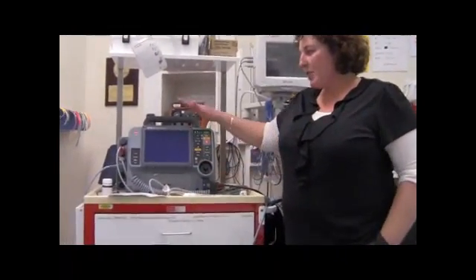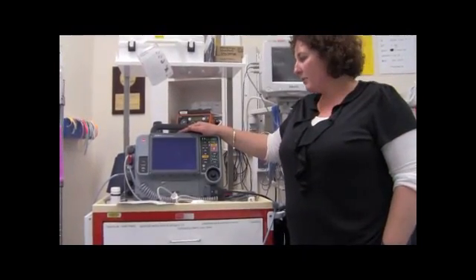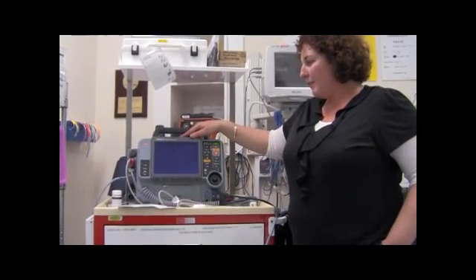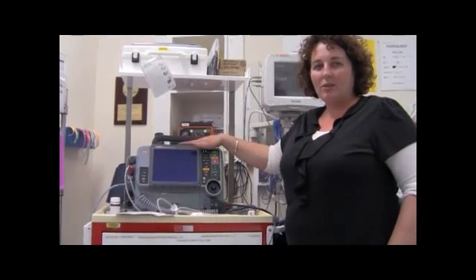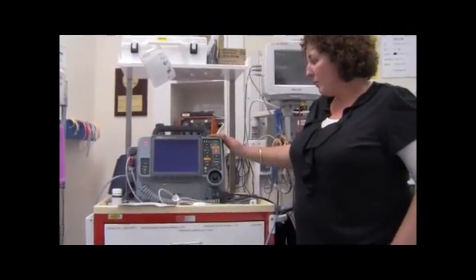So basically this machine is designed to monitor patients as well as to do some defibrillation of patients if required, and it can also pace patients. It has some facility to do a 12-lead ECG as well as invasive blood pressure and non-invasive blood pressure monitoring and end-tidal CO2 monitoring. But I thought we'd just keep it really simple today and just go through some of the buttons.